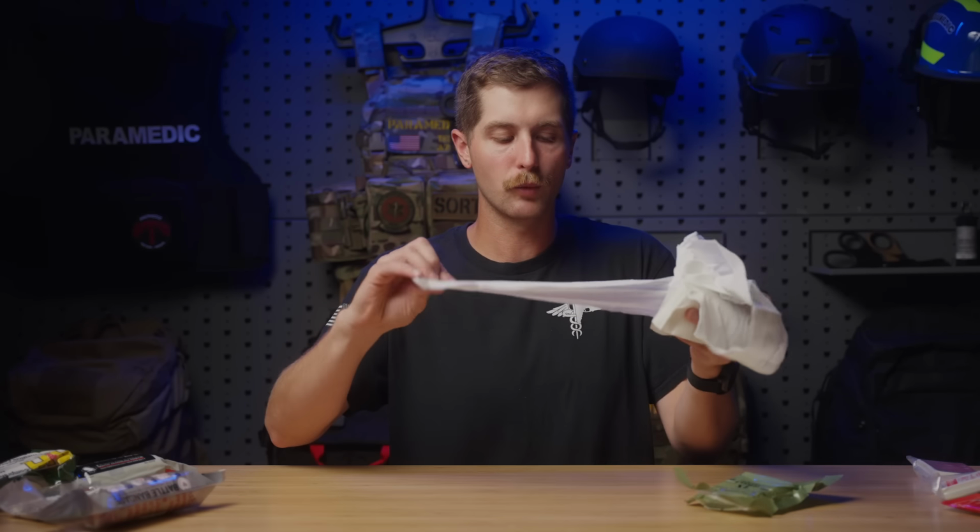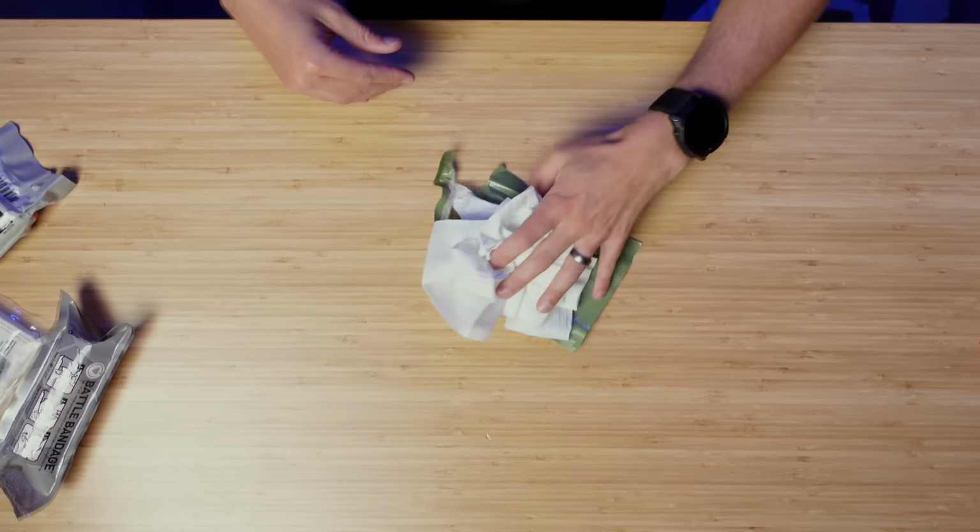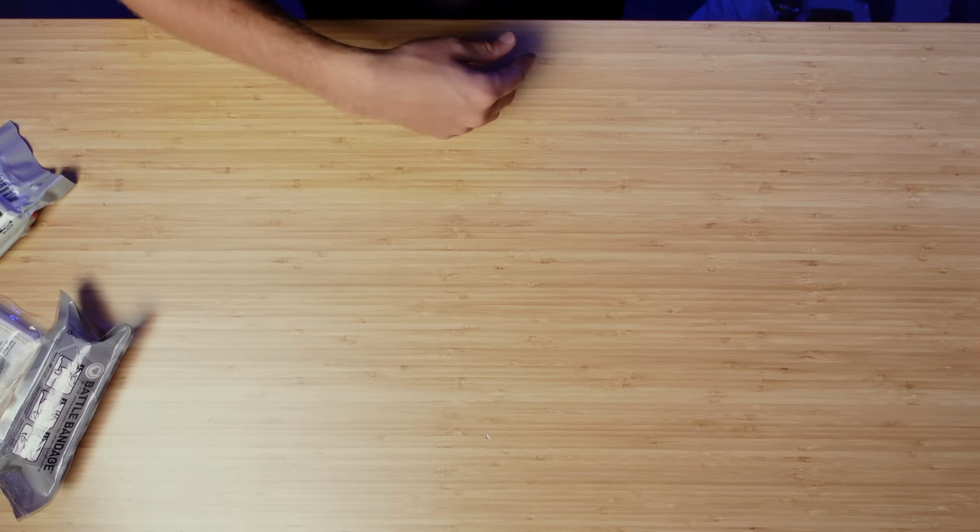This gauze is pretty clean. It is impregnated with that hemostatic agent, but it's not really gonna make things messy. Gets your hands maybe a little bit of a residue, but that's just about it. Very safe. You don't have to worry about it too much.